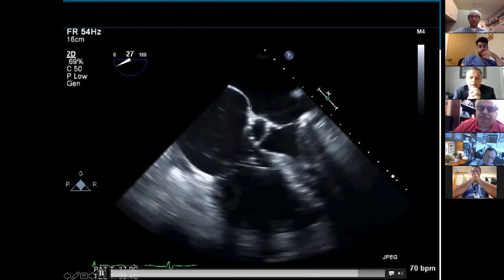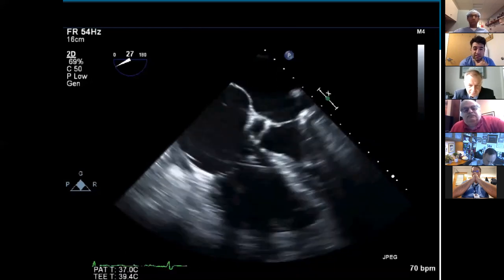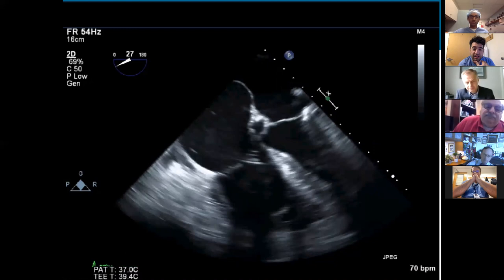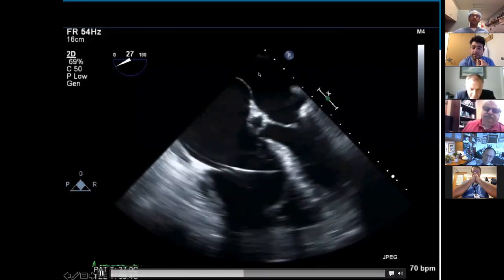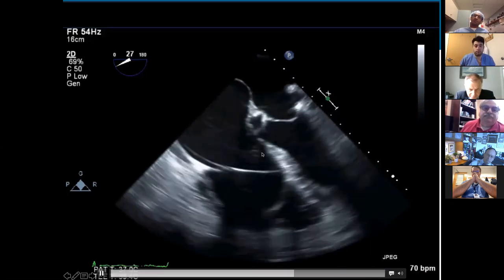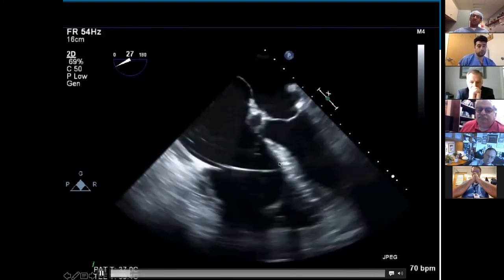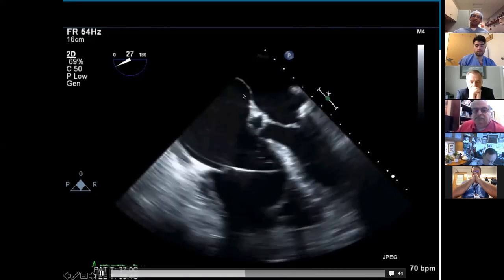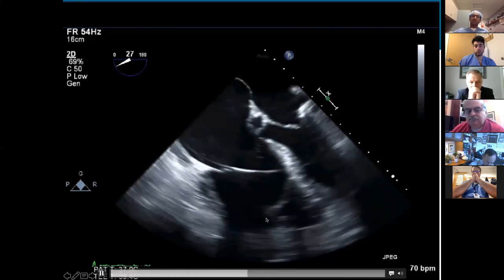Looking at another four-chamber example: the interatrial septum is bowed very much into the left side, suggesting right-sided volume overload; the RV looks dilated and there's turbulent flow — possibly agitated saline. The right atrium is bigger than the left atrium, and the right ventricle is bigger than the left ventricle — all signs of a problem. A useful teaching point from Mike McCord: if the bowing of the ventricles is hard to see because they're thick, pan up to the atria — they function under much lower pressures and you'll see the right atrium bowing into the left atrium, giving you a sense something is going on with the right heart.